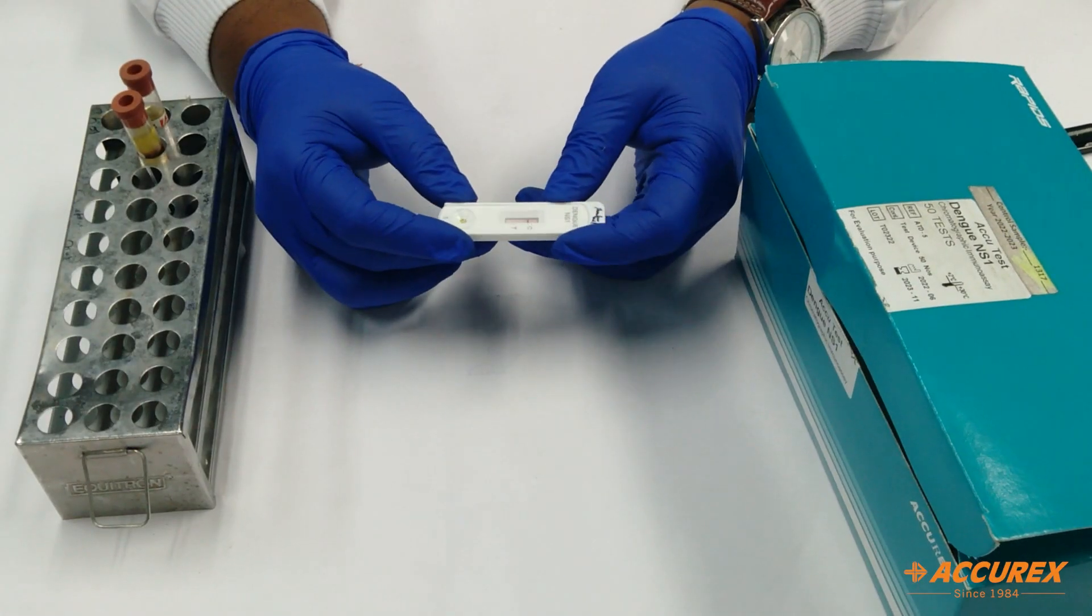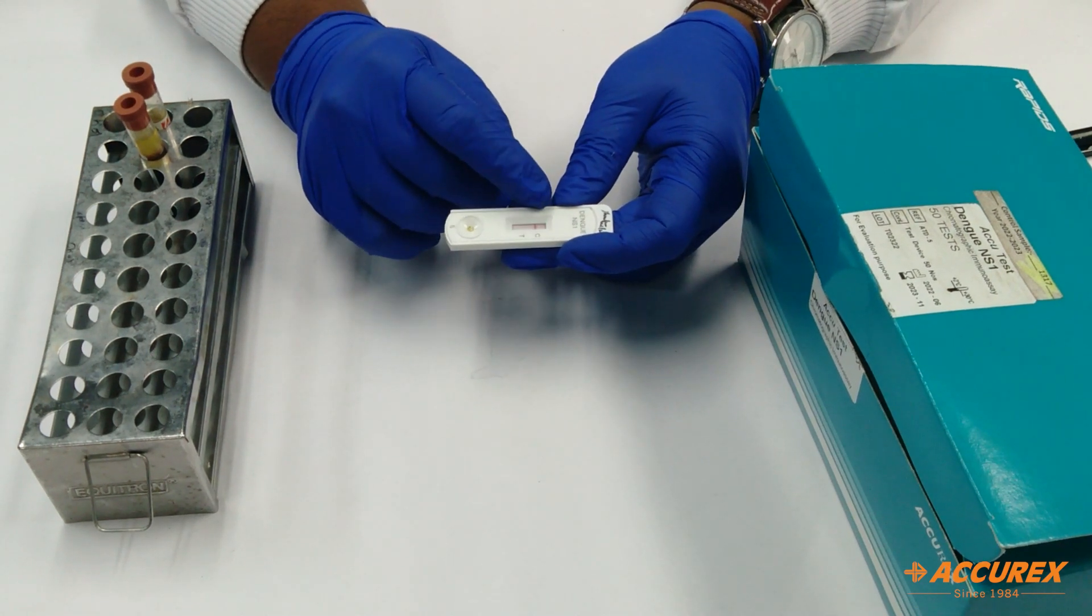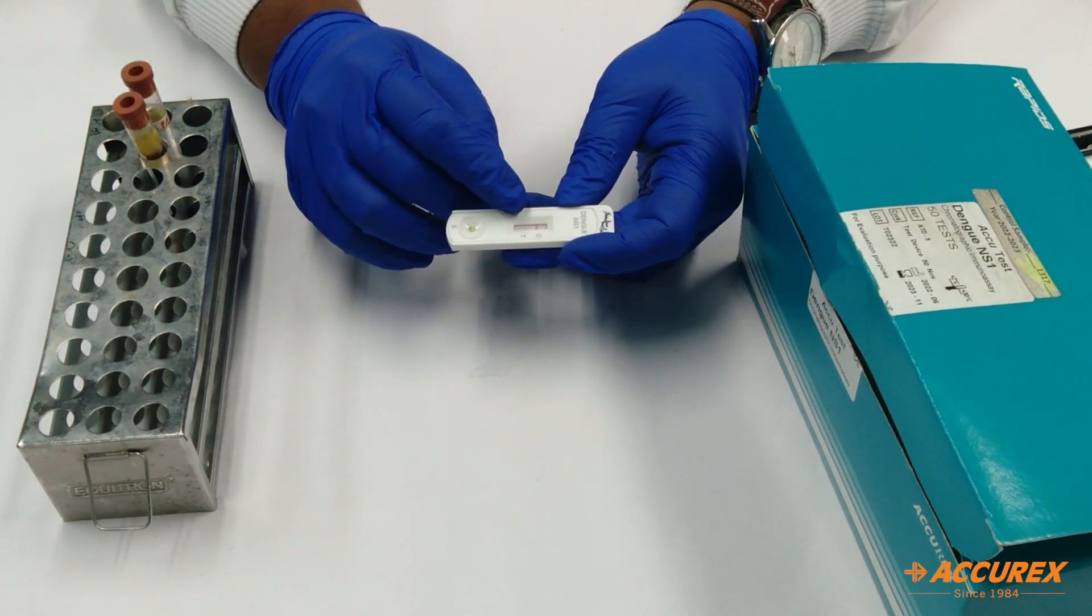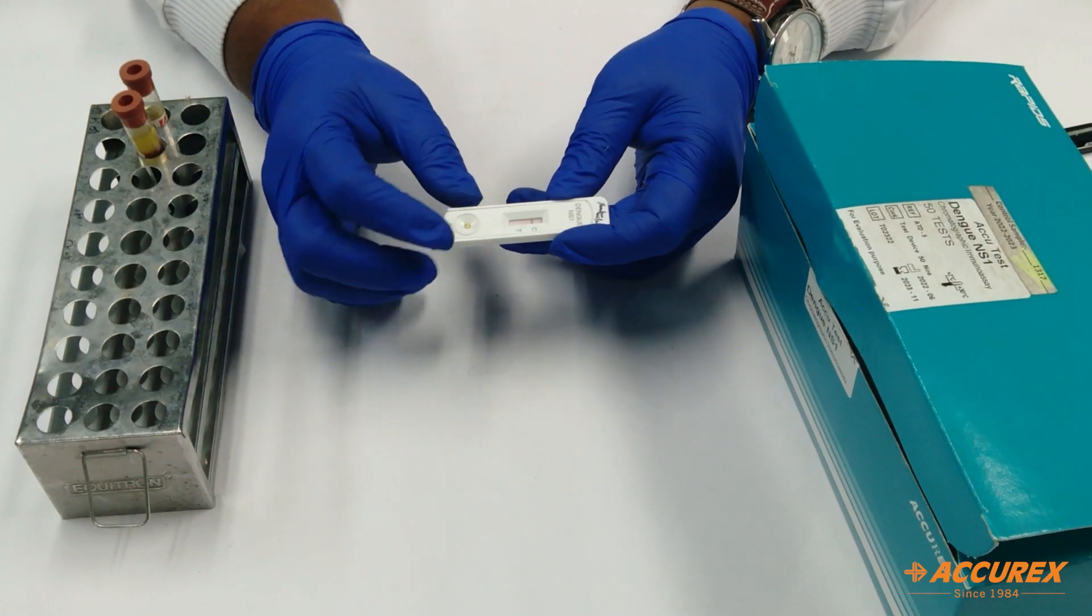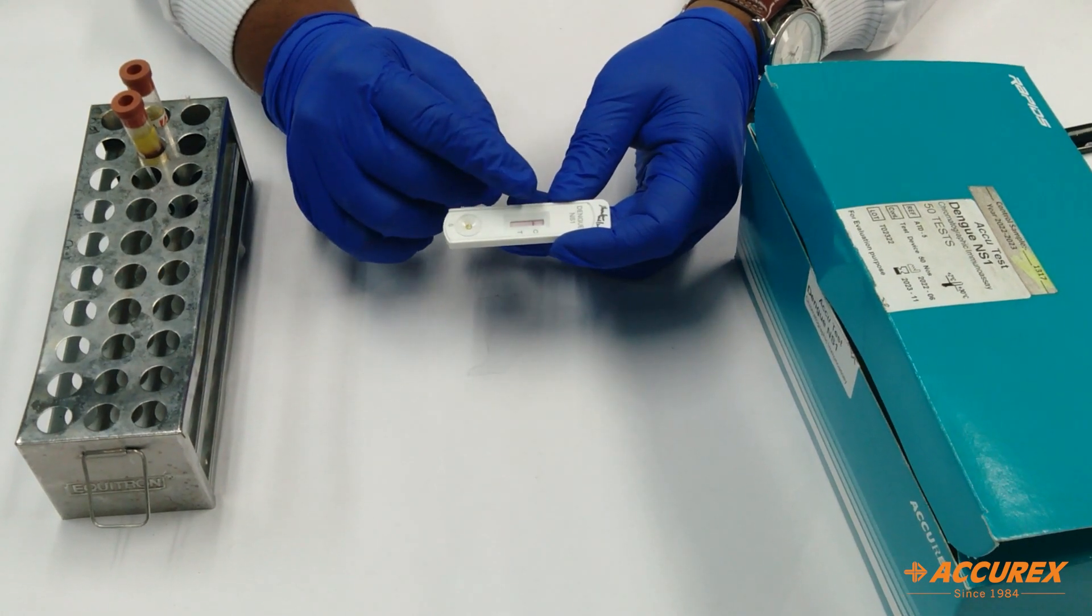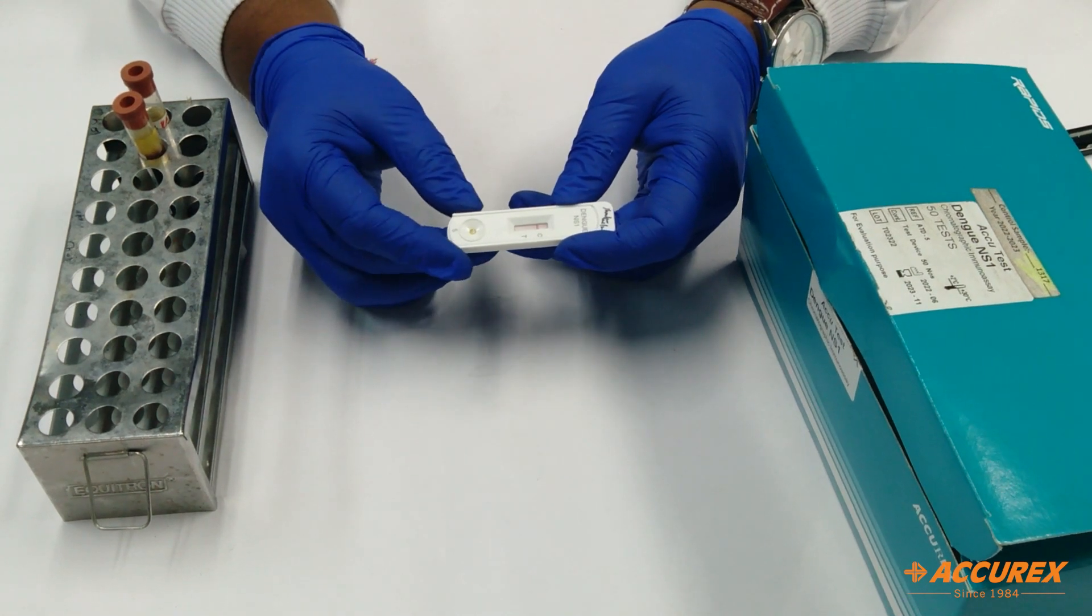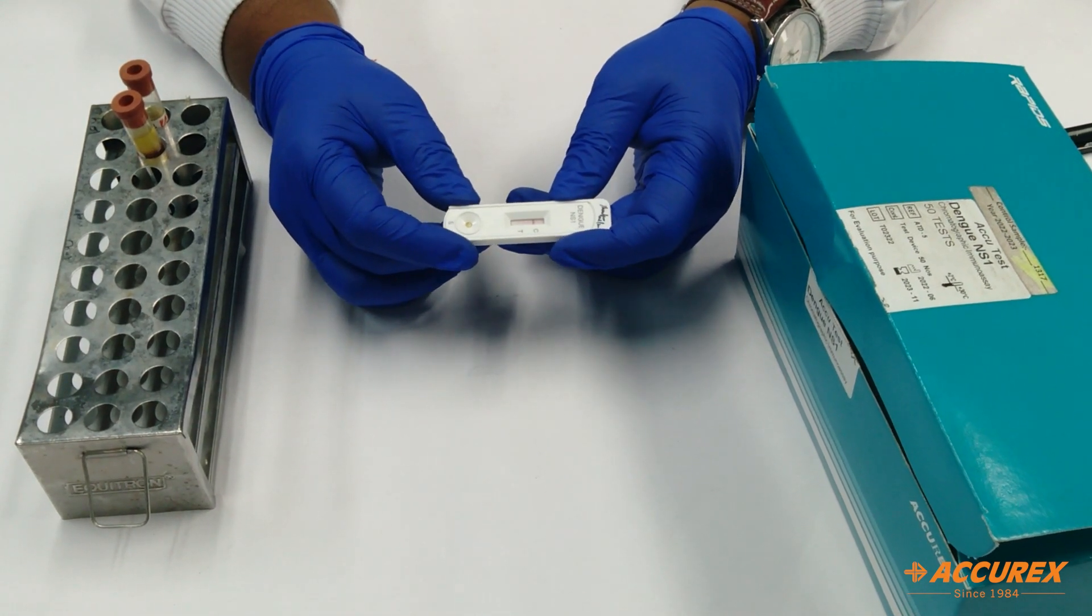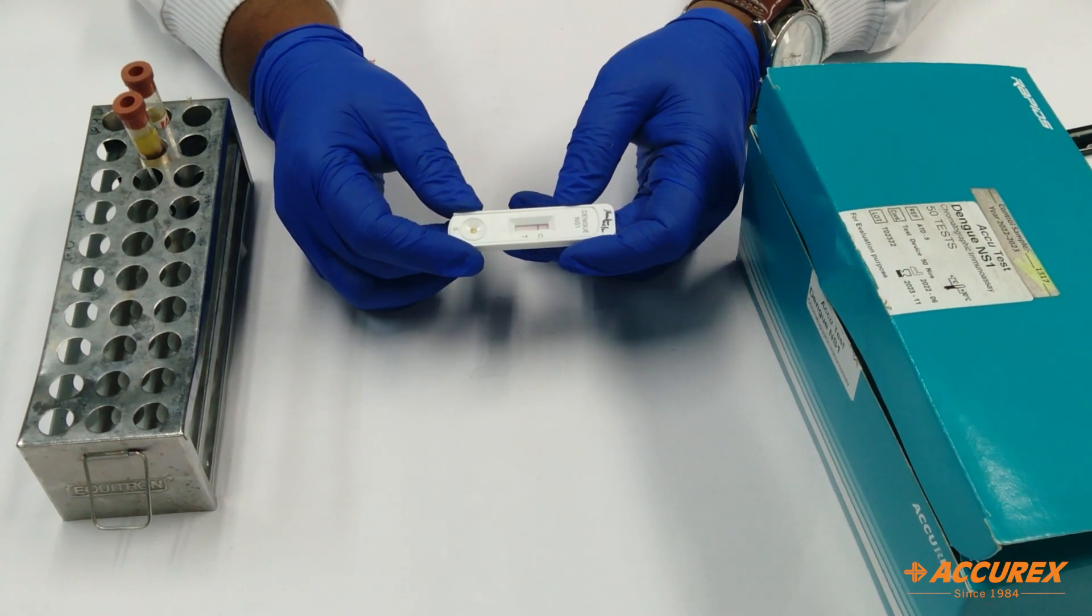The 15 to 20 minutes have been completed. Now you can see the band has appeared at the control line, and there is no band at the test line—this means the dengue NS1 is negative. If there is a band line at test, it means positive. If there is no band at control, it means the card is faulty and you need to check with another card. In this way, you can give the result in 15 to 20 minutes to the patients. Thank you.